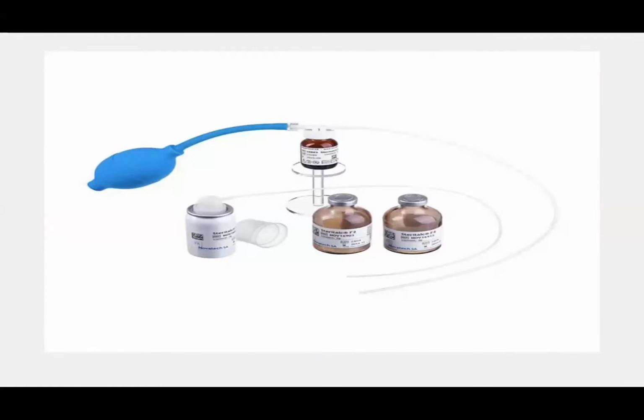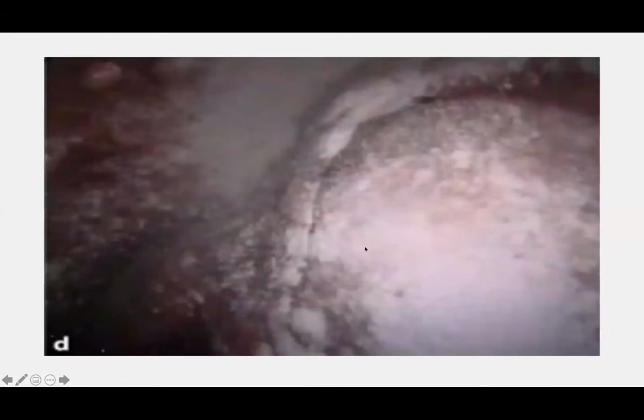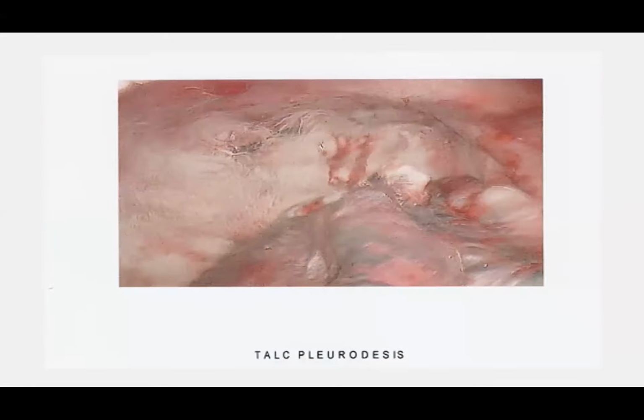So this is the picture. The nice thing about this long catheter is that you can widely spread the talc inside the pleural cavity on the surface of the visceral pleura and parietal pleura. This is the general picture that you are going to find at the end of your pleurodesis. In the first 2 hours, usually we don't put the patient on suction, just for the talc to become adherent to the surfaces. After that, we can put the suction for the lung to keep expanding and to cause adhesions between the parietal and visceral pleura.